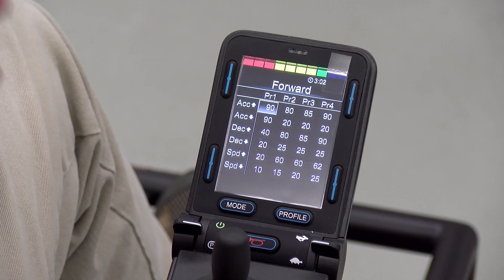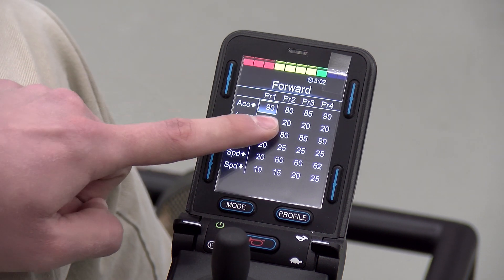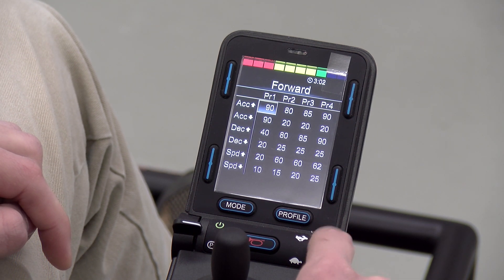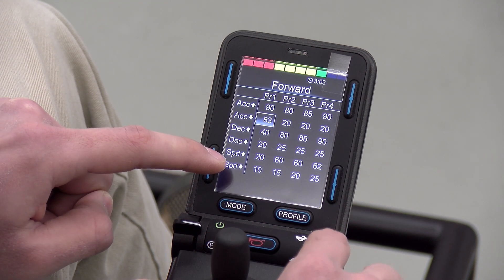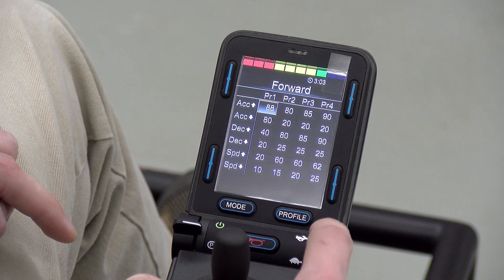A common question that we get is: why can't I turn down my settings? You can see that the maximum acceleration is set to 90 and cannot be turned down. The reason for this is because the minimum acceleration is also set to 90, and the maximum cannot be lower than the minimum. So what we need to do is turn down the minimum setting in order to turn down the maximum.